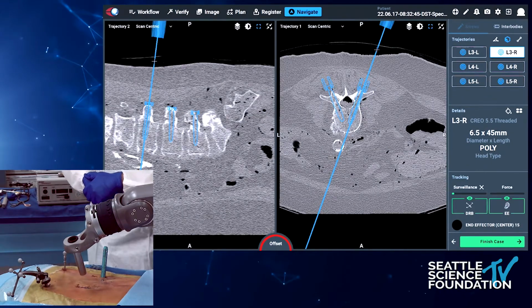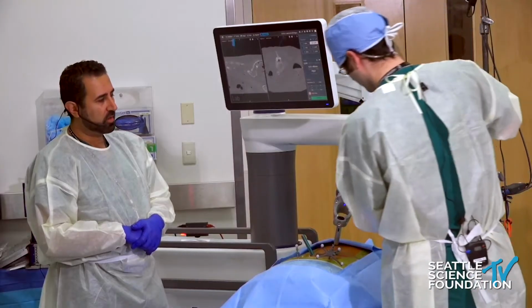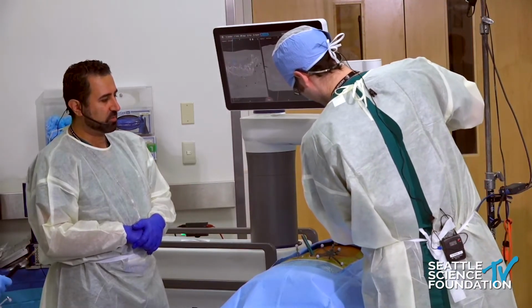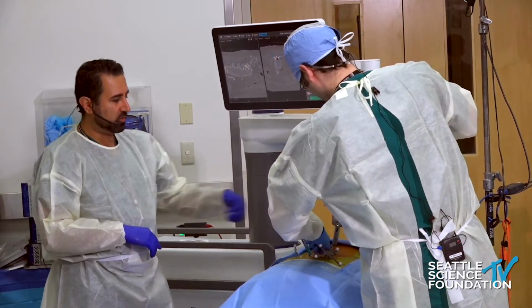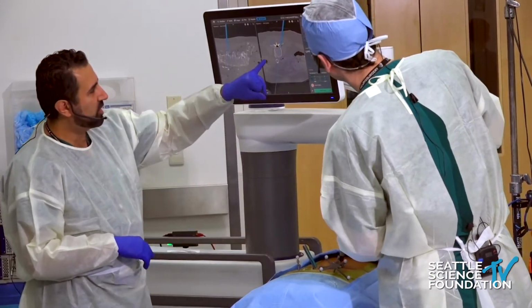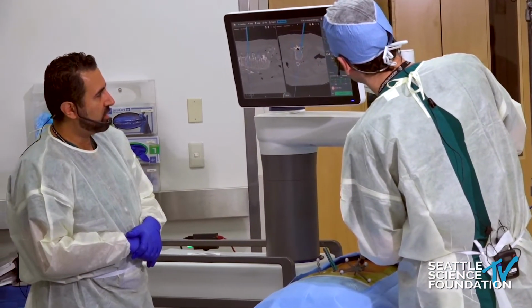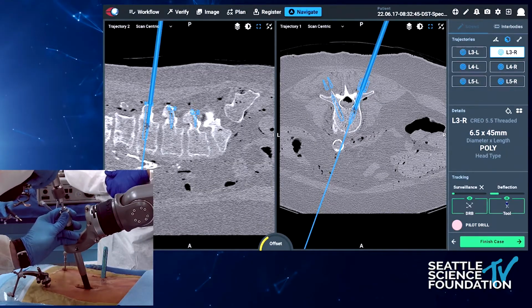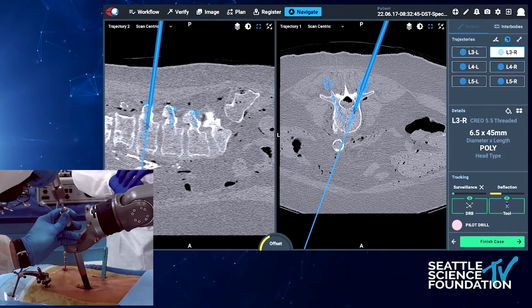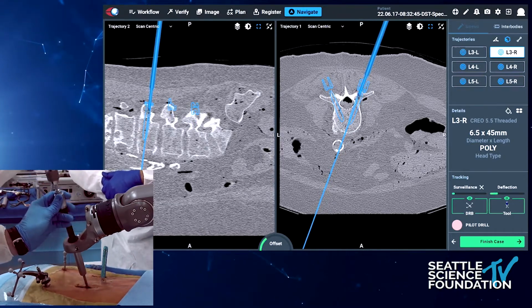Often my incisions are the same, I'll use the tap on this side, and maybe even slightly larger compared to if I used K-wire and X-ray. But the benefits are, of course, the accuracy, the increased trajectory. So again, same deal. Make a slight, yep, there's a micro adjustment. And then onto the bone, all the way down the pedicle until you've maxed out, and you can see the flange there. So he's maxed out. And now Nathan's ready for the screw.